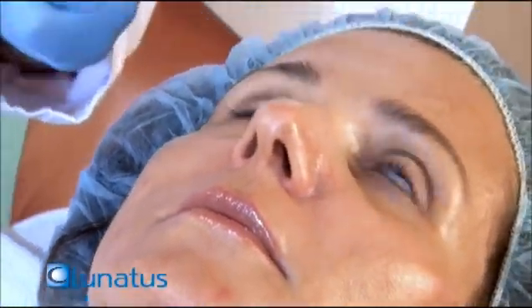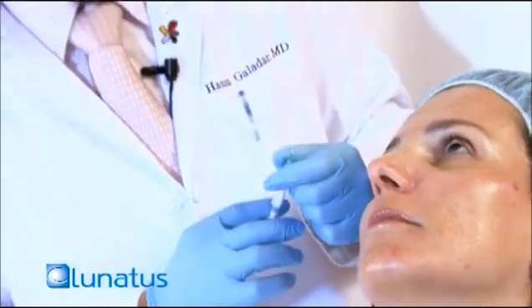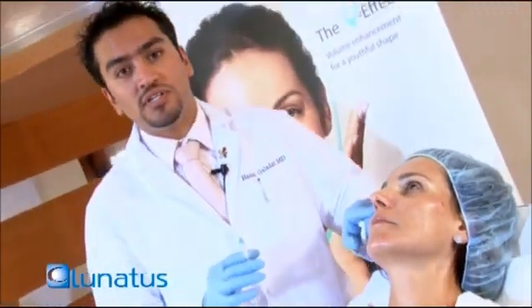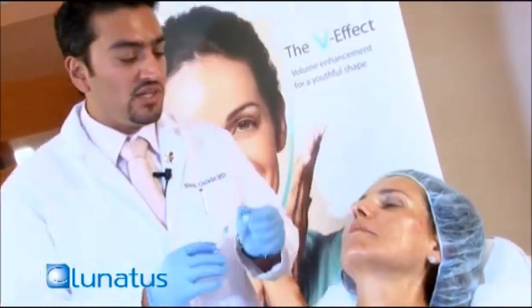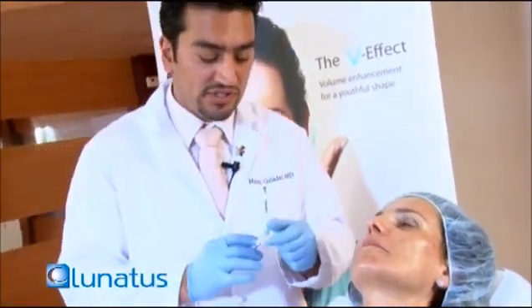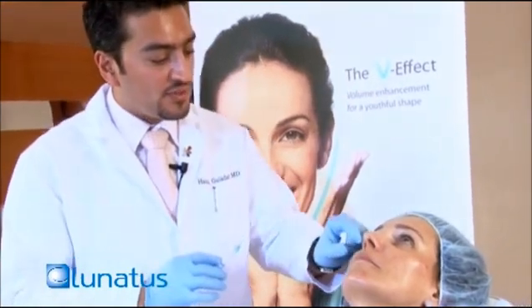I like having my eyes basically do the talking for me, but it is not wrong using a surgical marker, especially if you've just started, and especially if you want to know exactly where your bony markers or your facial anatomy markers are going to be.